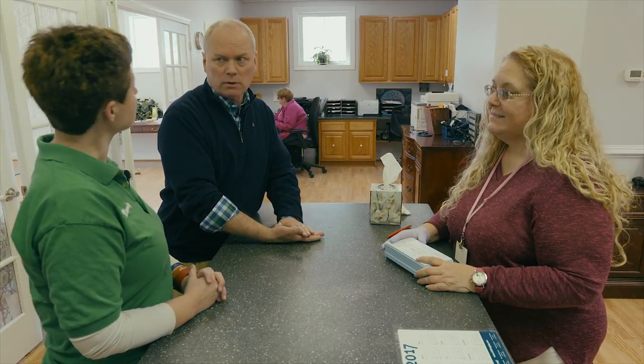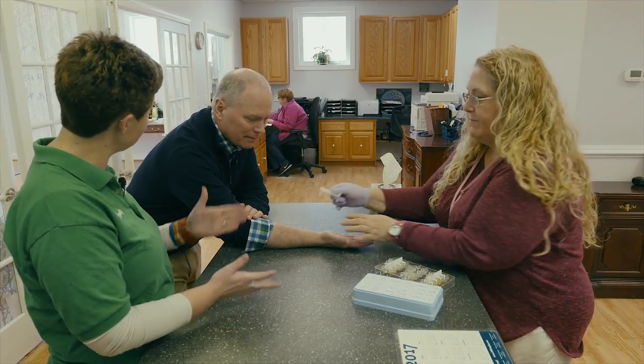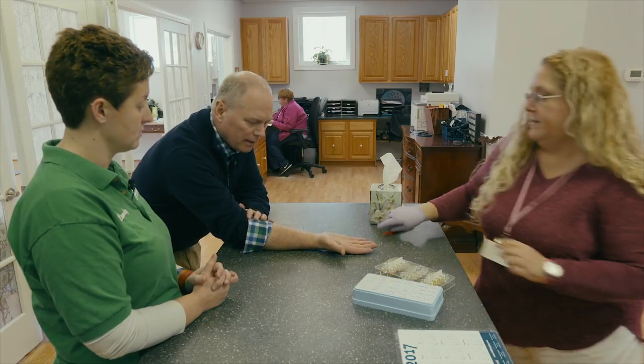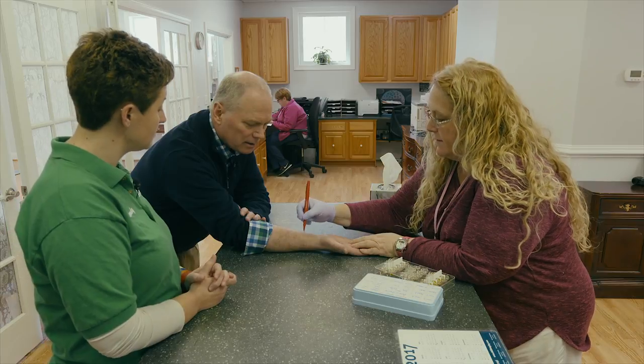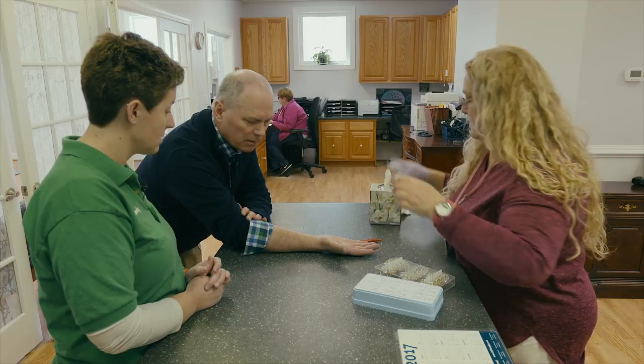Now, I happen to know that I'm allergic to grass. Okay. So Tara, my allergy tech here, is going to do a couple of tests. One for grass, one for a negative test, negative control, and another one for a positive control. So you can see how we do prick testing and see what happens afterwards and how big it gets. Perfect. So she's already prepped my arm. Okay, so most of it's done on the arm. Yes, and so you just place this, you rock it back and forth, and that's it. There are three little dots, as Mandy can certify there, little drops of various extract. Dabs them like that. There you go.